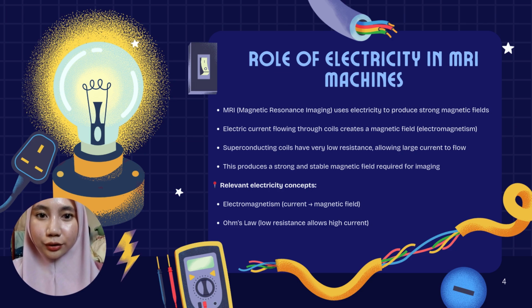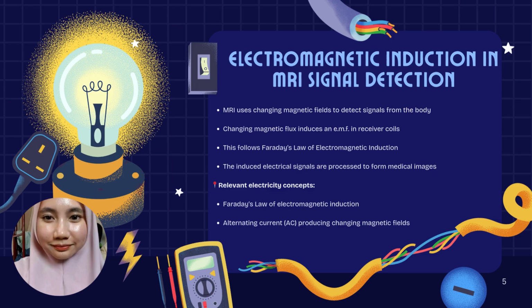MRI machines use superconducting coils. When these coils are cooled, their electrical resistance becomes almost zero. According to Ohm's law, when resistance is very low, a large current can flow. This large and continuous electric current allows the MRI machine to produce a strong and stable magnetic field, which is necessary to obtain clear and accurate medical images.